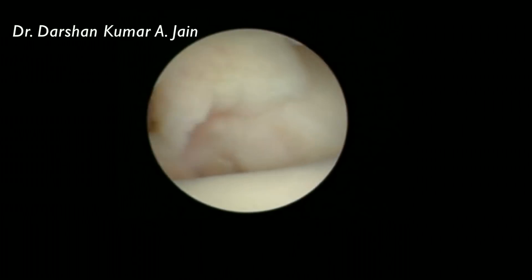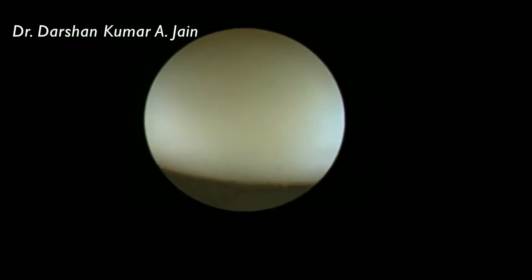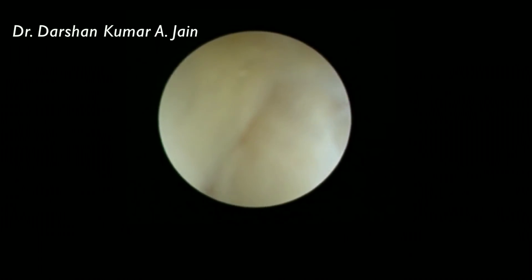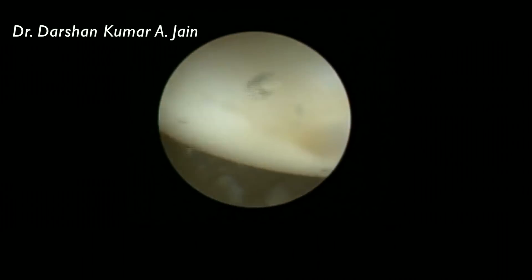Now we turn our attention towards the ulnar side. That's the lunate which is seen. And further as we go across, that's the triquetrum with the capsular reflections as well as synovial hypertrophy towards the ulnar side. This synovial hypertrophy on the ulnar side demonstrates the unrest in the joint.